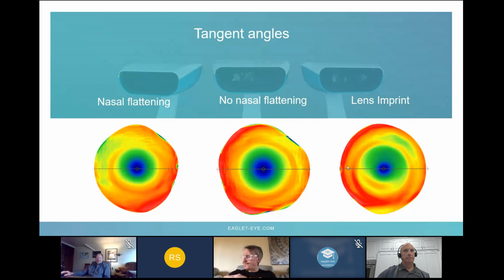Barry, how do you handle scleral imprints? What is your recommendation? Yeah. Myself being a keratoconic myself, I know, I can't go without my lenses for a week. I can't function, and that's how our patients are.